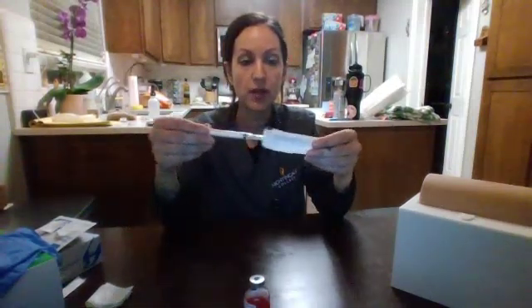I'm in the med room and I'm going to be gathering my supplies. So I have a vial of morphine that reads 4 milligrams per ml. So I'm going to be administering 1.5 mLs of medication for the patient. My supplies include the morphine vial, a 3 ml syringe with a 25 gauge, 1 inch needle, a gauze pad, 2 alcohol prep pads, and gloves.